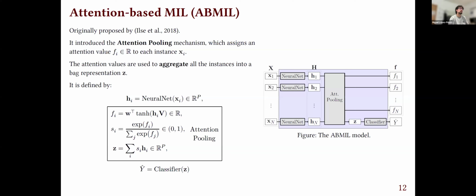And then the last question here, how to approach multi-class classification with MIL, where we have only few slides, like around 100 in total, and some groups have only around 20 slides. Yeah, I think this is the major problem when you are working with medical data. You don't have labeled data. Even if you use multiple instance learning, you will end up, as you said, having 20 slides.